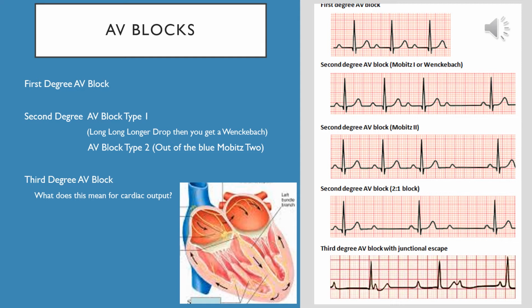The way that you can tell that this is a third degree AV block is you can get a ruler or some sort of measuring stick or a piece of paper and make some marks on it. You want to evaluate the P waves and see where they are lining up. You will notice that the P waves are very consistent, coming out at the same rhythm generally, and you can see these P waves marching through the junctional rhythm. Sometimes the P wave falls on a ventricle depolarizing, and it may be hidden or right along the side of it.